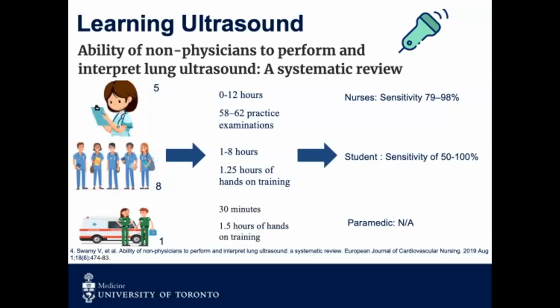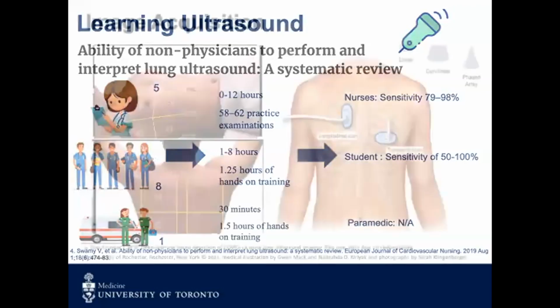And the paramedics, there was only one study. They had 30 minutes of didactic training and 1.5 hours of hands-on training. And the endpoint for this study was predefined as greater than 80%, and unfortunately, they did not meet that. So what this shows you is that lung ultrasound is a learning curve, but it doesn't take a whole lot of hours to get there. Definitely less than cardiac echo.